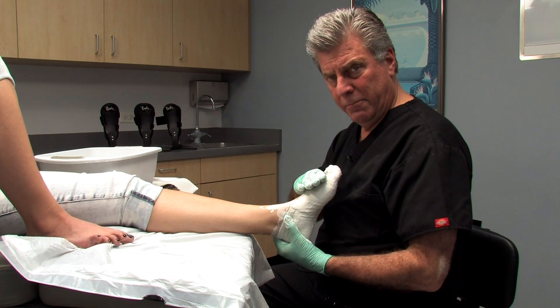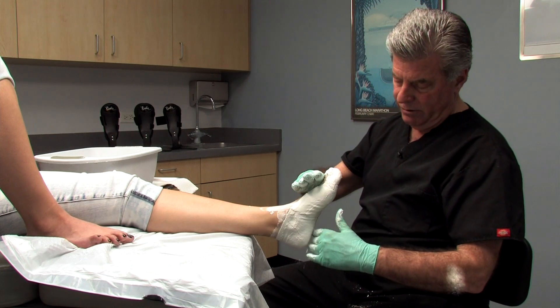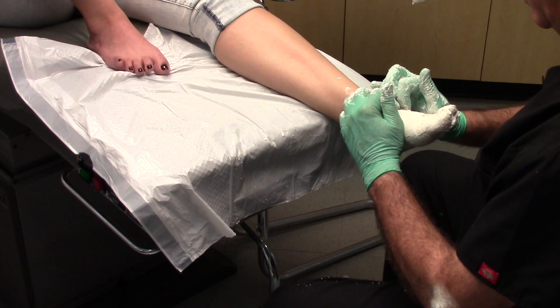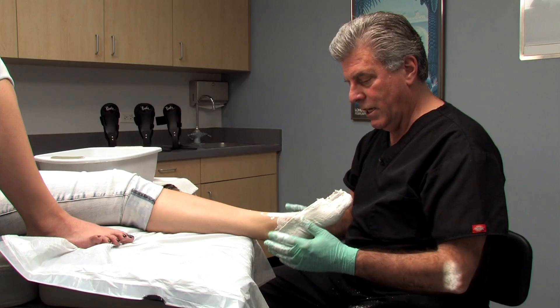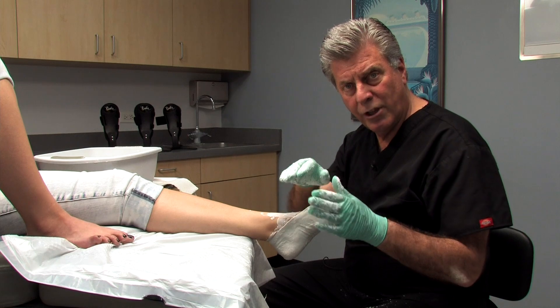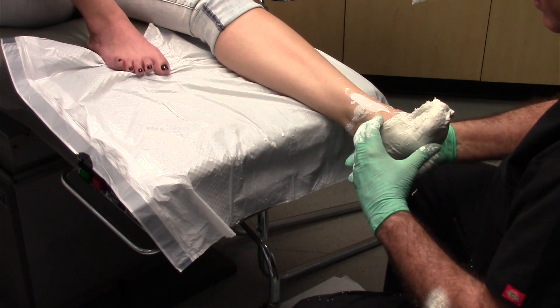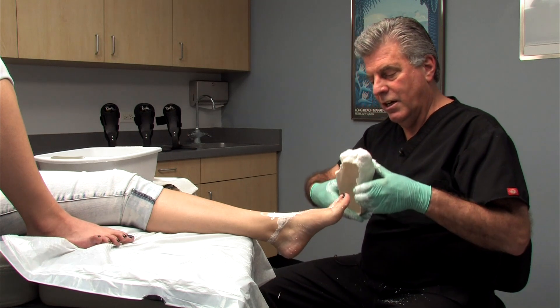Since you're going to be casting both feet, a good technique is to not remove this cast right away. Loosen it just slightly over the top, leave it there, and move to the other foot to duplicate the process. When you're done with the other foot, come back to the first, gently lift at the very top, pull from the heel down, and try not to distort the forefoot of the cast as you bring it off the front of the foot.